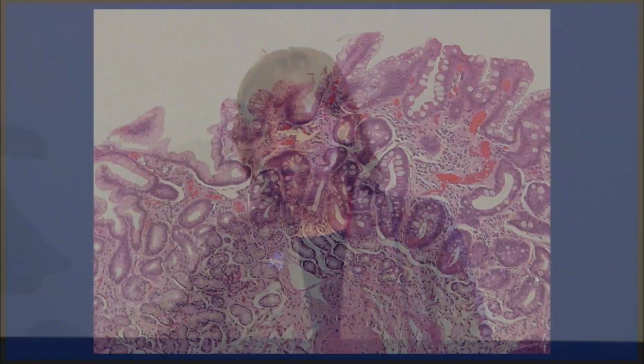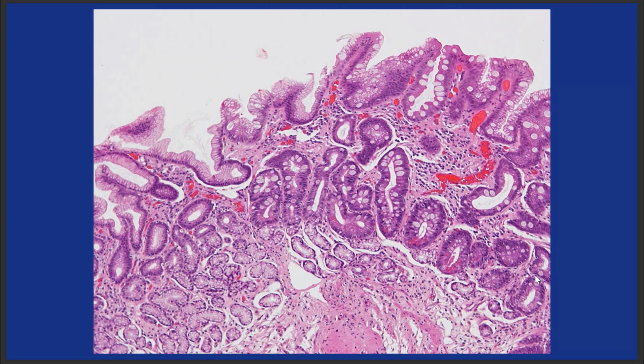Going back to basics, which I like the most, these are just plain H&E. So if you have a good biopsy, good size, well-oriented, and a perfect section, this is all you need to classify complete versus incomplete.